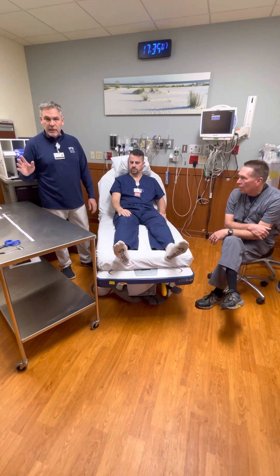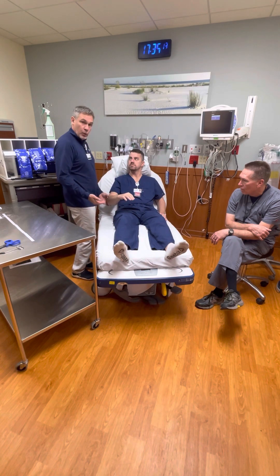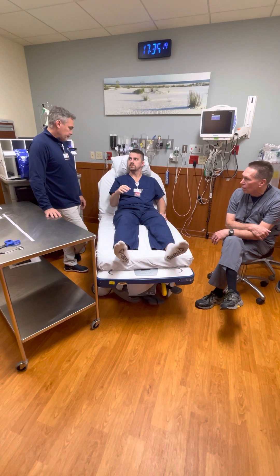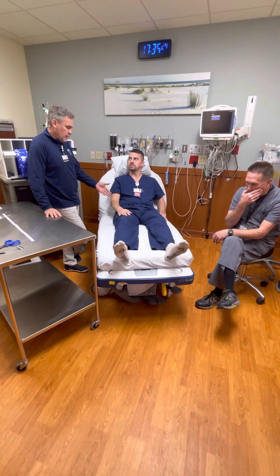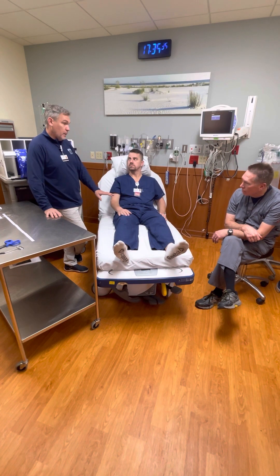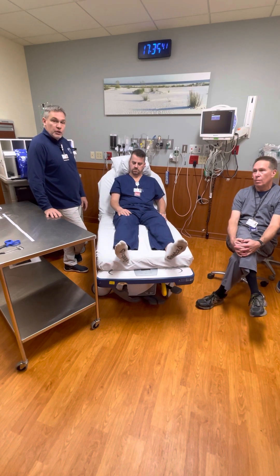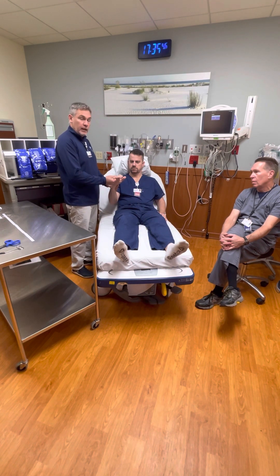In this case, first thing we do is look at the x-ray, know where the fracture is, then come to the patient and explain exactly what we're doing. Explain that you've done these before and you know how to do these. You're going to go through all of the instructions alongside the patient as you do it and explain what you're doing because they don't know what's happening and they're going to be very protective of this arm. They're very sensitive. You might need to have somebody else come in with you - often you do - and there are different positions and ways to position the hand while putting a splint on.